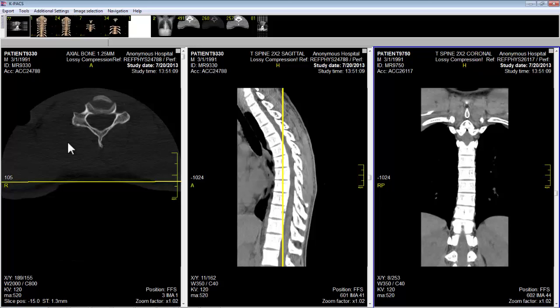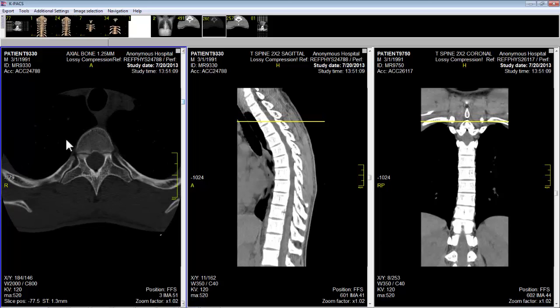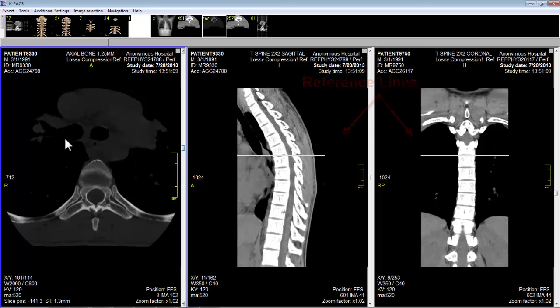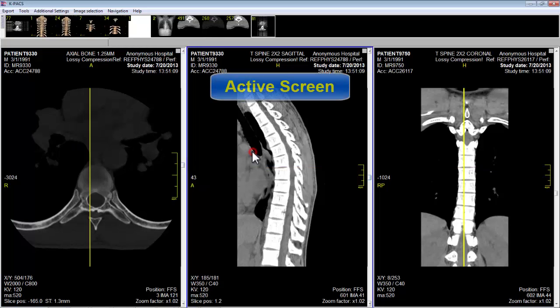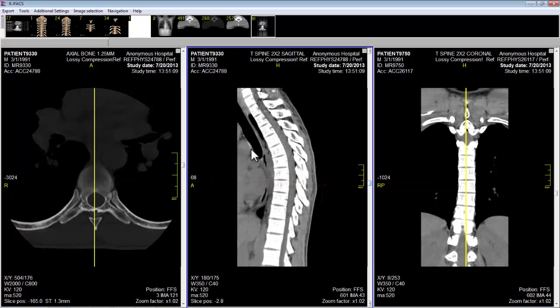Now it will be the axial sections that are active, and I can scroll through all 266, or whatever it is, axial sections. Now you notice something: as I scroll through these axial sections, there are yellow lines in the sagittal and coronal views. That shows you where the axial section is taken in these other two image stacks. If I go to my sagittal section and click on it to activate the middle tile screen, when I scroll through that screen, you notice that the yellow line goes through the axial and coronal, so I can tell exactly where the sagittal section is taken.